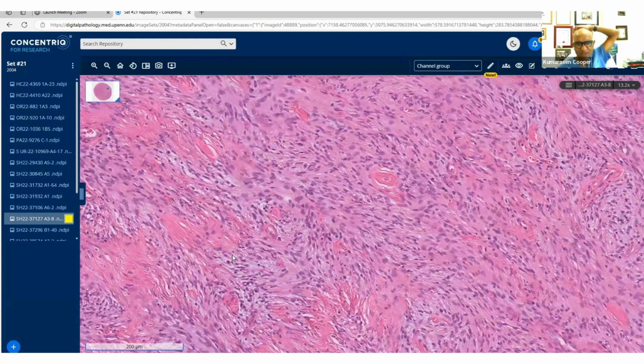In which case, I'd like to see some actin positivity. If it's myofibroblastic, this is in the thigh, male. And if it's proximal thigh, you may think of things like myofibroblastoma, in which case you'd want desmin to be positive. CD34, we already said, is positive. And then you'd want an estrogen receptor, which is very useful in myofibroblastoma.